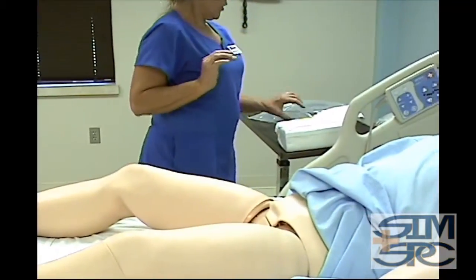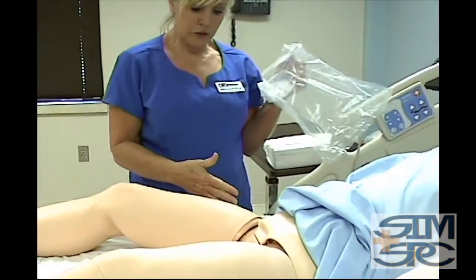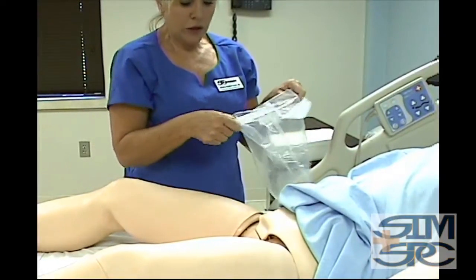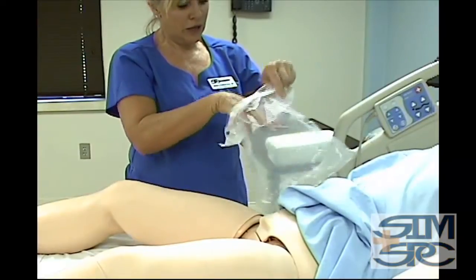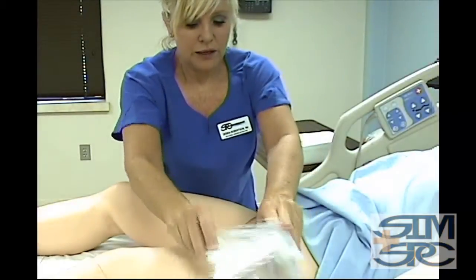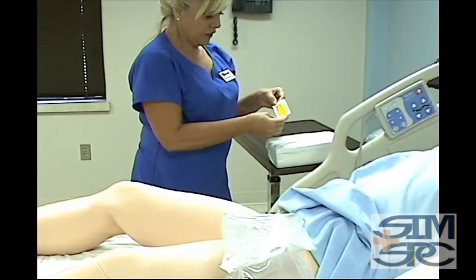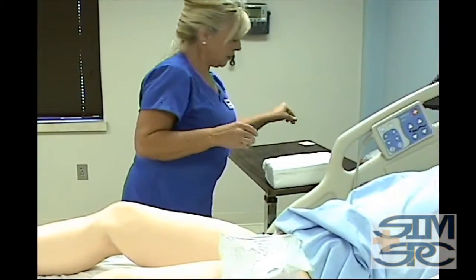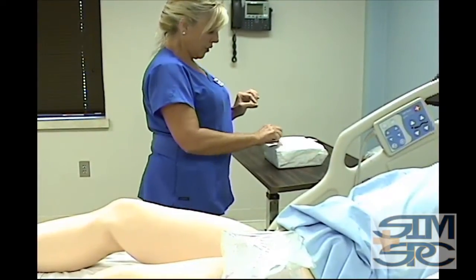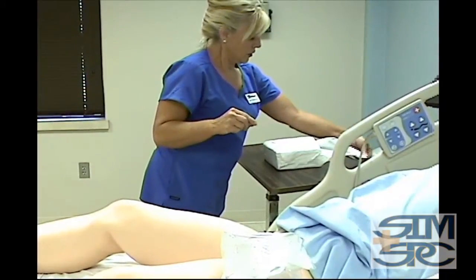Okay. We're going to take this and place it here on this side. Usually I'm going to go across to the opposite tip from the one you're working from. That way you don't cross this way and tend to contaminate. Alright, then this is your insertion and date of insertion. This is a tag. We can lay that there. Okay, we're going to open away from us first. And you have that 1-inch border that we were telling you about.